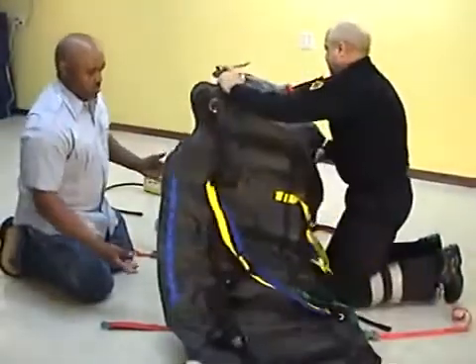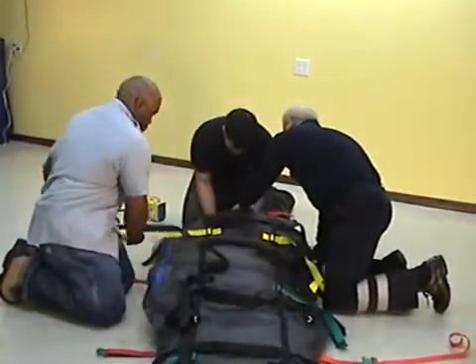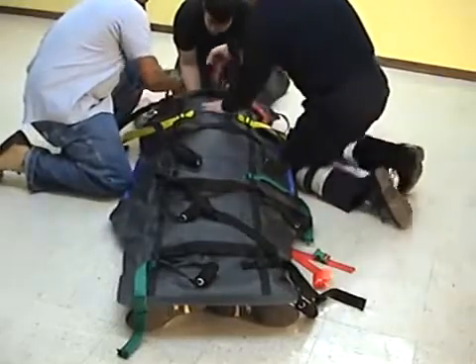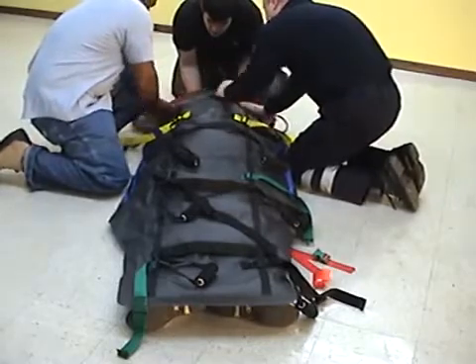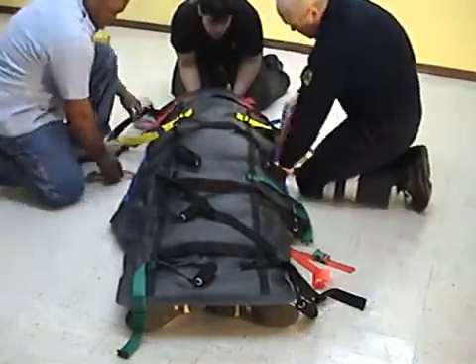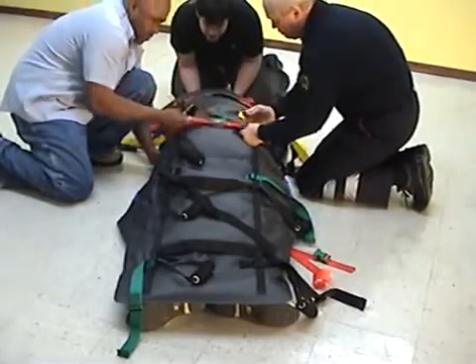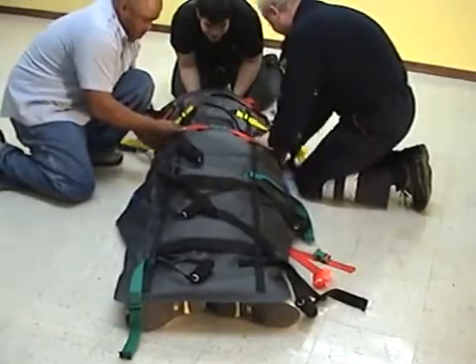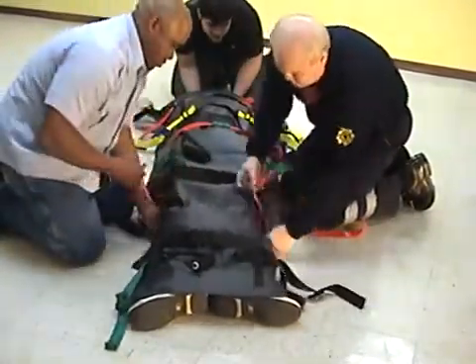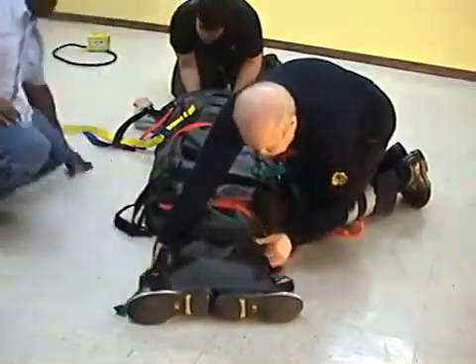The designated left rescuer unfolds the VSB and places it like a blanket over the patient so that even the head is covered. Close the straps tight behind the patient's back. With the aid of the other rescuers, head changes his hand position to encompass also the VSB, thereby holding the VSB molded around the head and neck. Firmly form the VSB around the patient while pumping the air out.